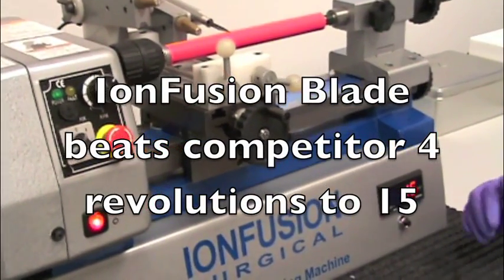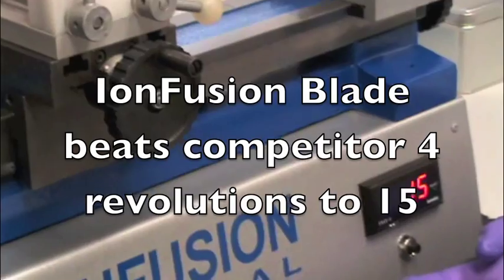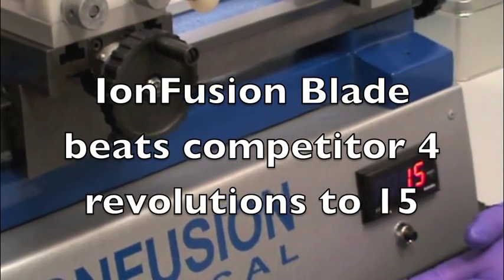As you can see, it took 15 revolutions for competitor B's number 11 scalpel blade to cut through the test.